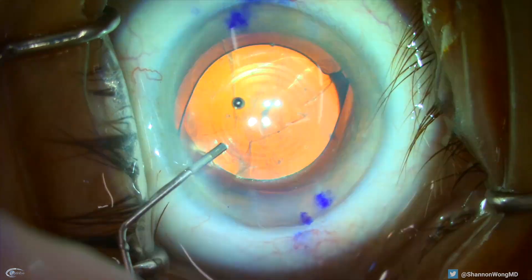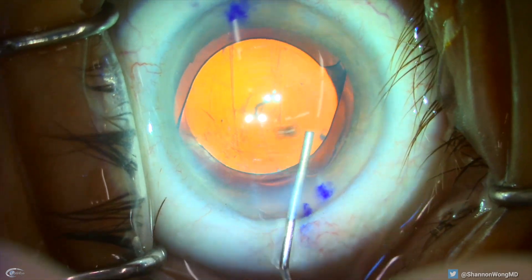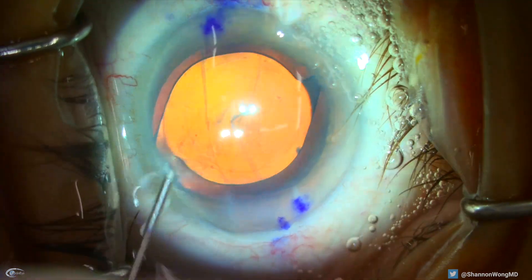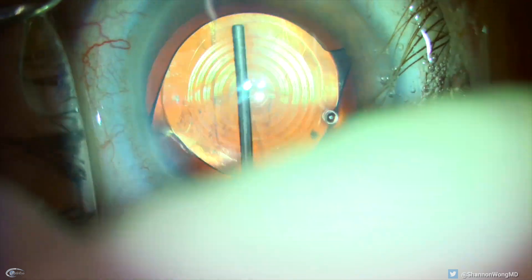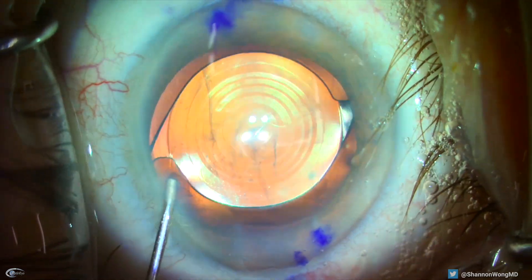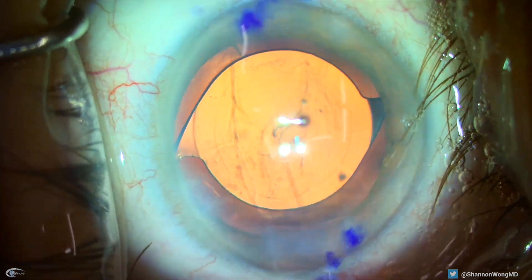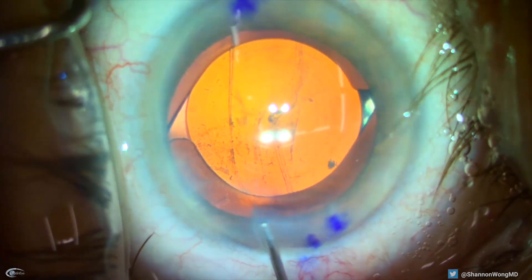Now, to remove the viscoelastic, we flush the anterior chamber with balanced salt solution and choose not to use the irrigation and aspiration handpiece, which would potentially cause inadvertent displacement of the panoptics lens from its position inside the capsular bag. We can see that the panoptics is perfectly centered with the haptics in an area of the capsule that is stable and intact at three and nine o'clock.